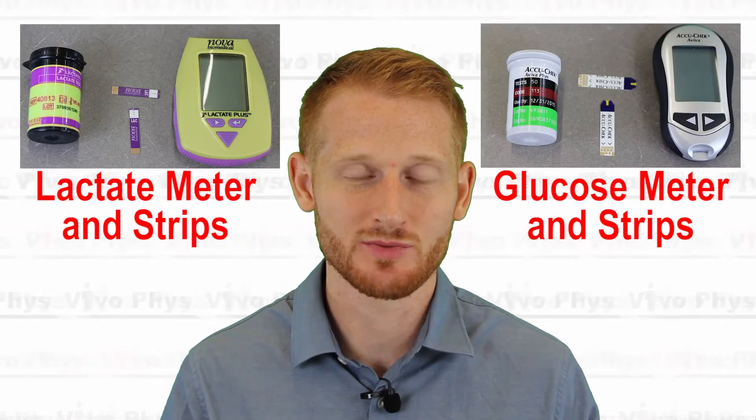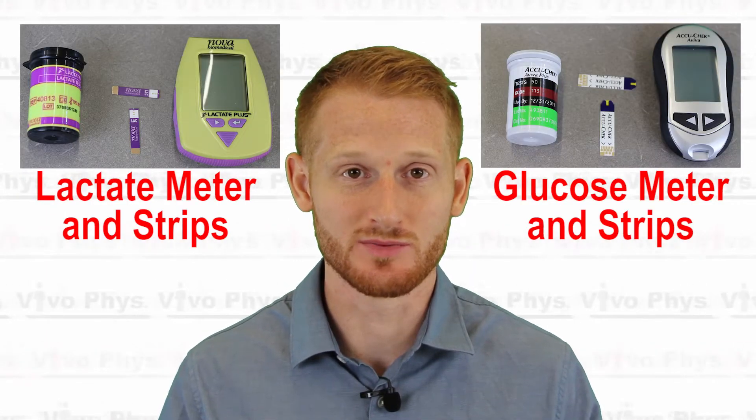And with that small blood sample, we're going to do a lactate measurement and a glucose measurement, so a blood glucose measurement.